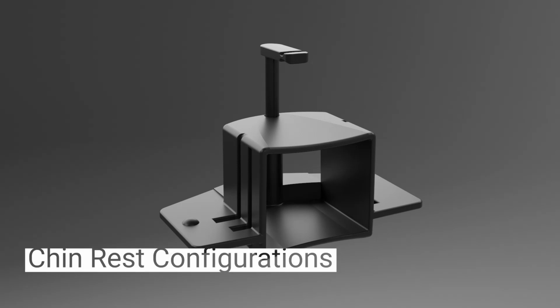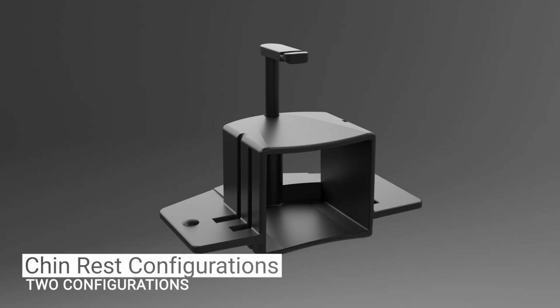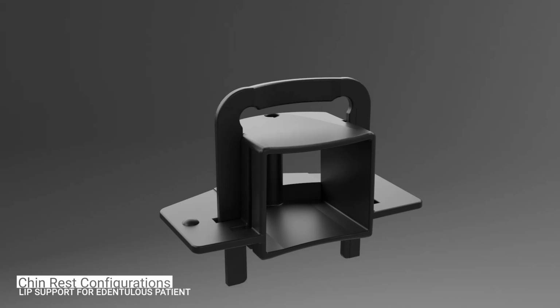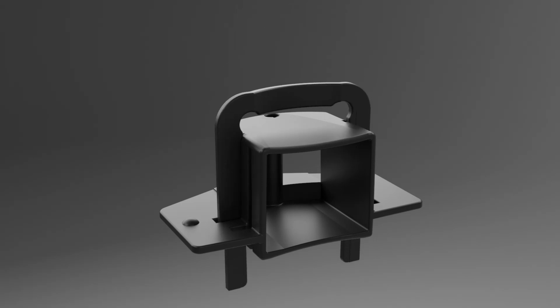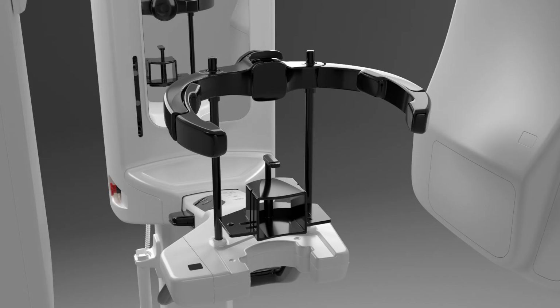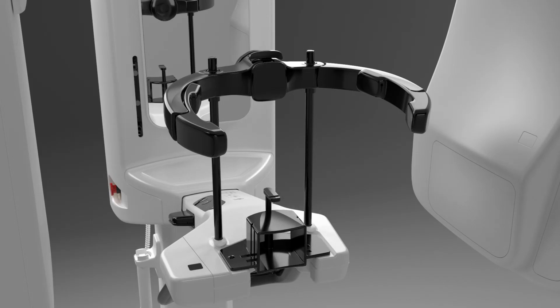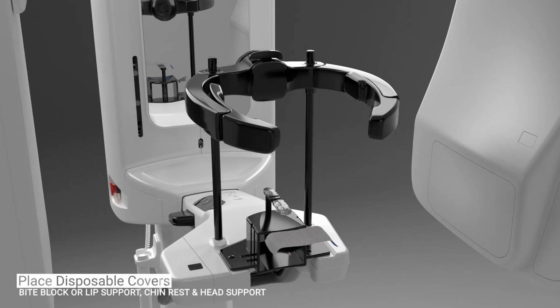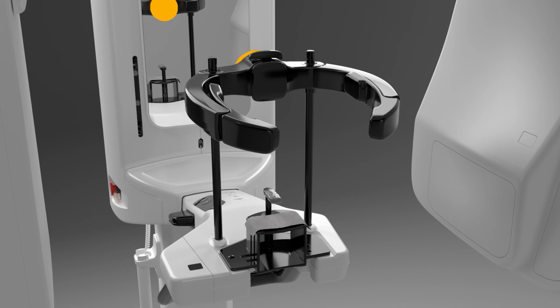There are 2 chin rest configurations that can be used when acquiring a 2D panoramic image: Standard Panoramic and Pediatric Panoramic. Both require the bite block and chin rest, except for edentulous patients that require the use of the lip support and chin rest. Pre-configure the chin rest and place it into the system. Place disposable covers on the bite support or lip support, patient chin rest. Open the patient head support, turning the knob on the head support counterclockwise.